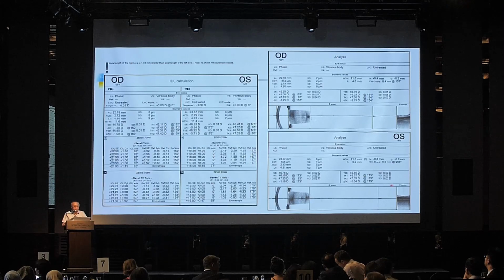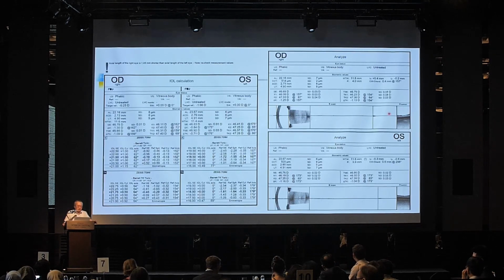This is just to show you the anisometropia, and I always look at this as well, what we call the fovea peak, to make sure that it is an optical axial length. That means measuring from the corneal vertex up to the fovea. If you don't see this, then you have to ask yourself, first, whether the patient is fixating, and second, is there something wrong with the macula?